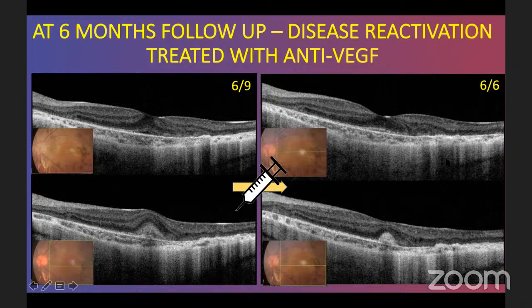So, sorry about that. To differentiate between the two, on the OCT, it's going to look the same unless and until you have a clinical feature. You could look at visual acuity as one marker because you don't expect a Best patient to suddenly drop in vision. The other thing is, with regards to a fluorescein angiogram, you can look at a very early phase and pick it up. But if there's no bleed and you're looking at a pseudo-vitelliform stage where you have an empty optical space, then it does become a challenge just based on OCT to pick it up.